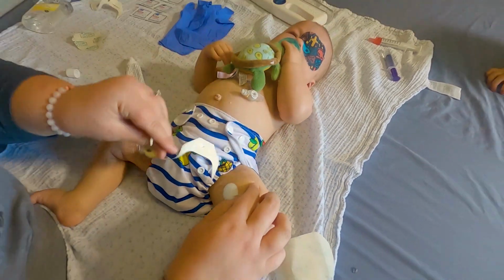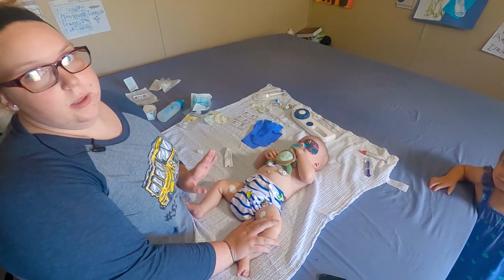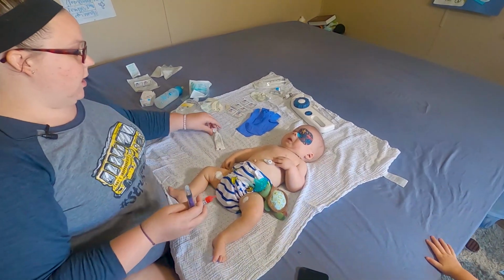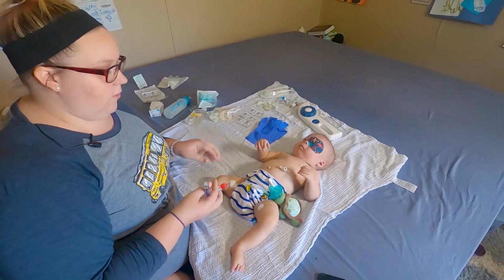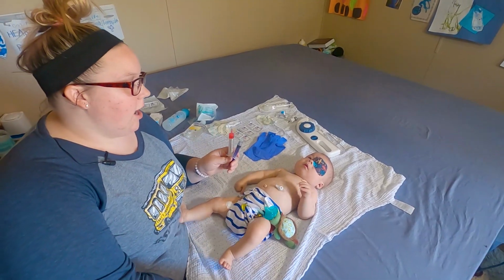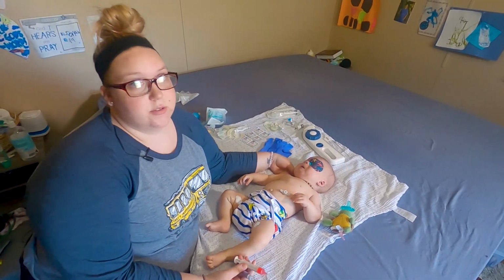So this particular lidocaine usually takes about 30 minutes to fully kick in. So we want to make sure that he gets the maximum benefit from it so he does not feel the needles going in. When Gabe was doing his chemo, we discovered he's very, very sensitive. And we figured out that he needs to have prophylactic medication, which means he needs to have it to make sure he does not have a reaction. He has had a reaction. He's broken out in hives from this medication.